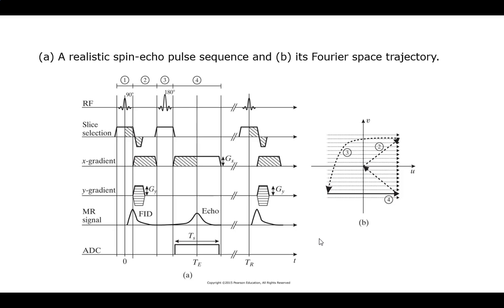So it's not as bad. This one is literally one-sided because you don't have the other side, because you haven't started the pulse yet. Right? So as much as you want that to be perfect, it's not going to be perfect on there. So now you have to fix both the one-sided nature as well as whatever effects go on. On this one, since it is 2-sided, it's a little more balanced. And so I can take advantage of that, and time is money.